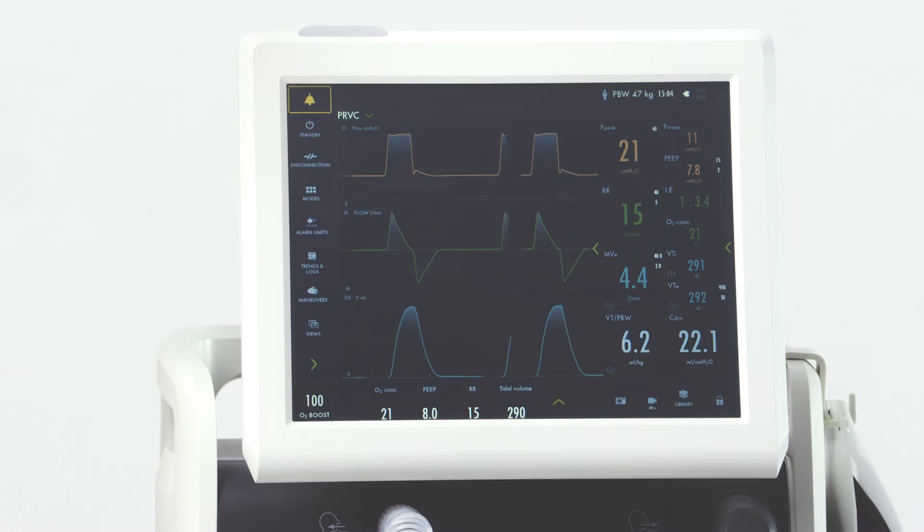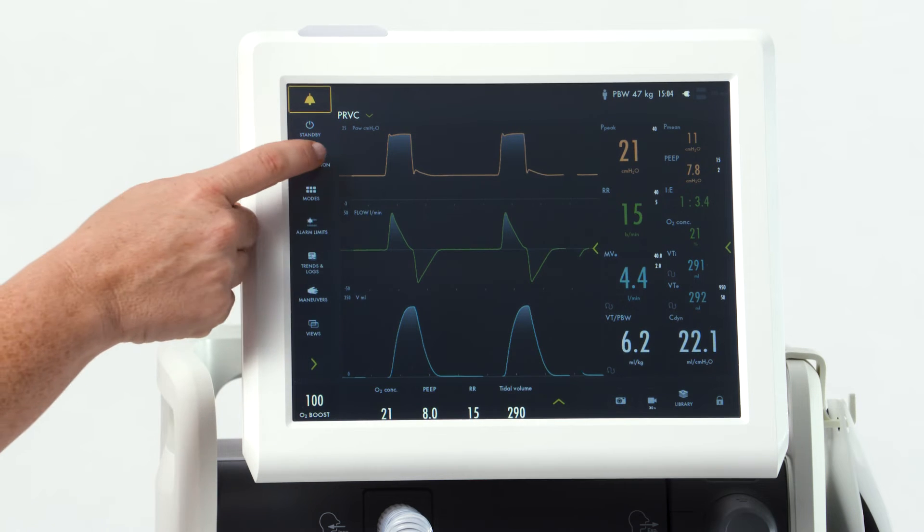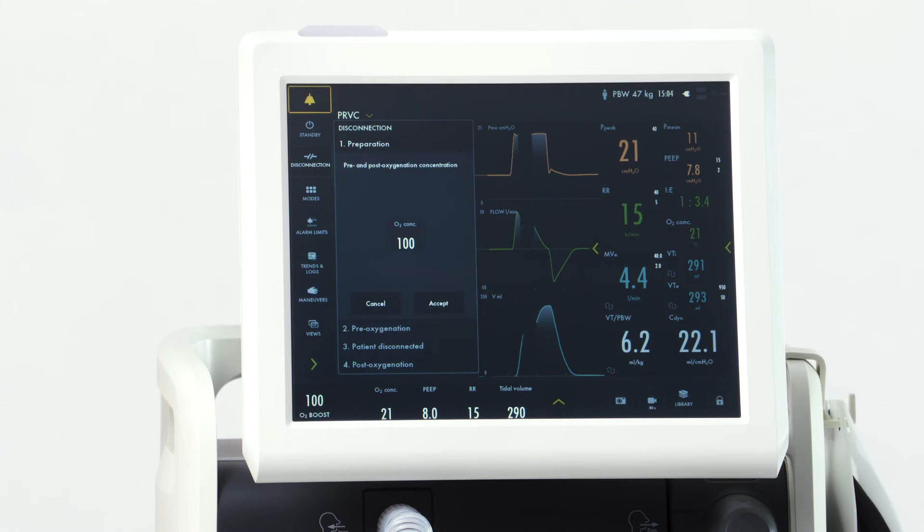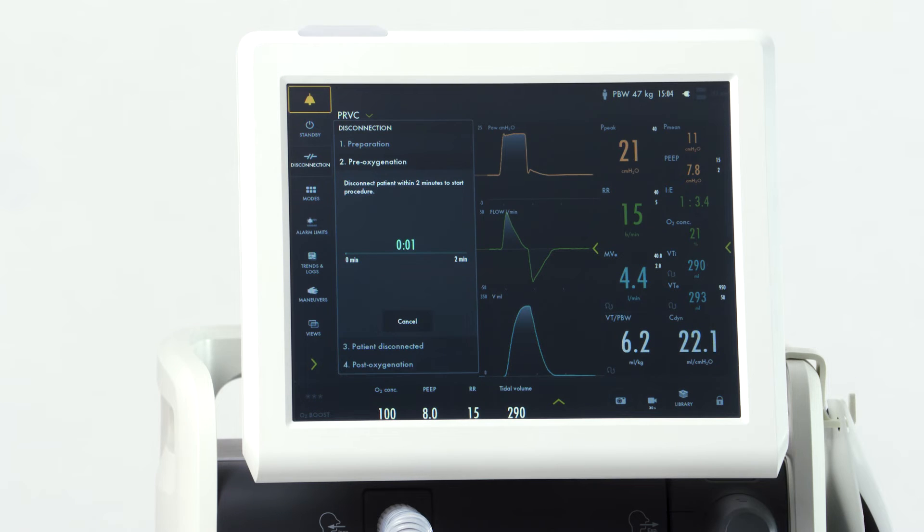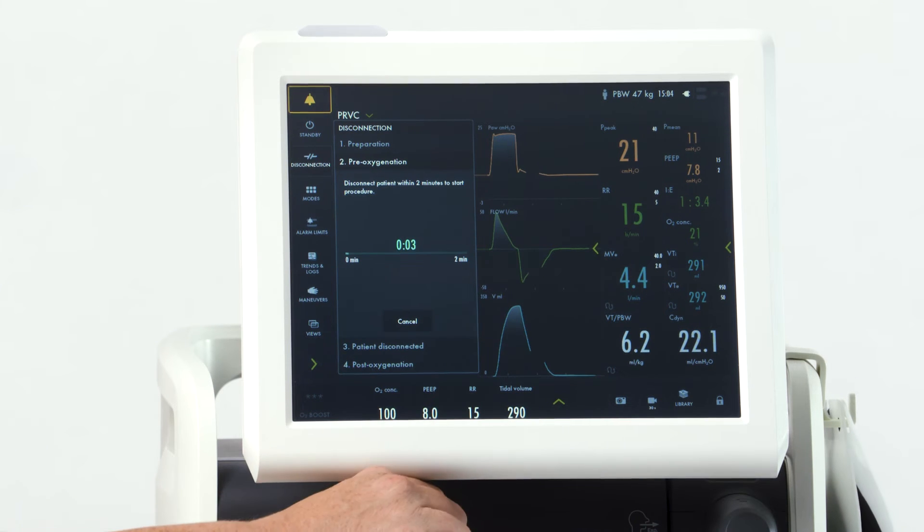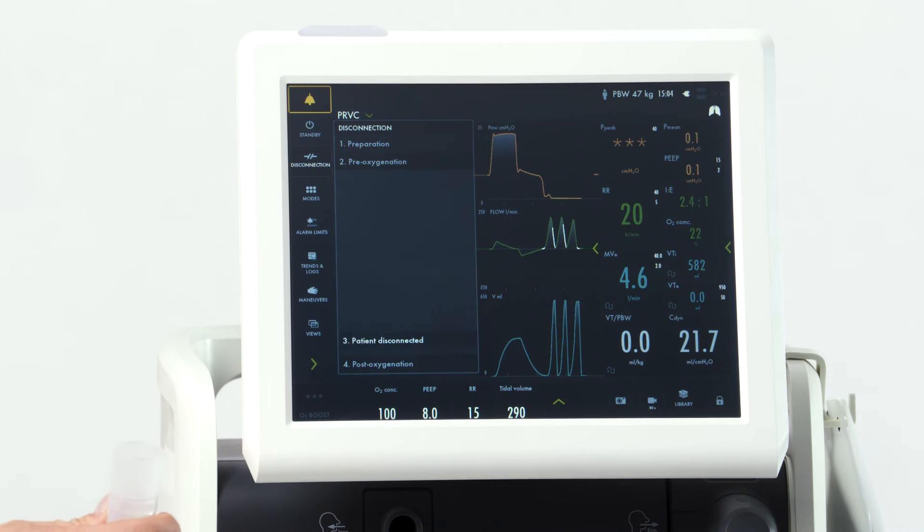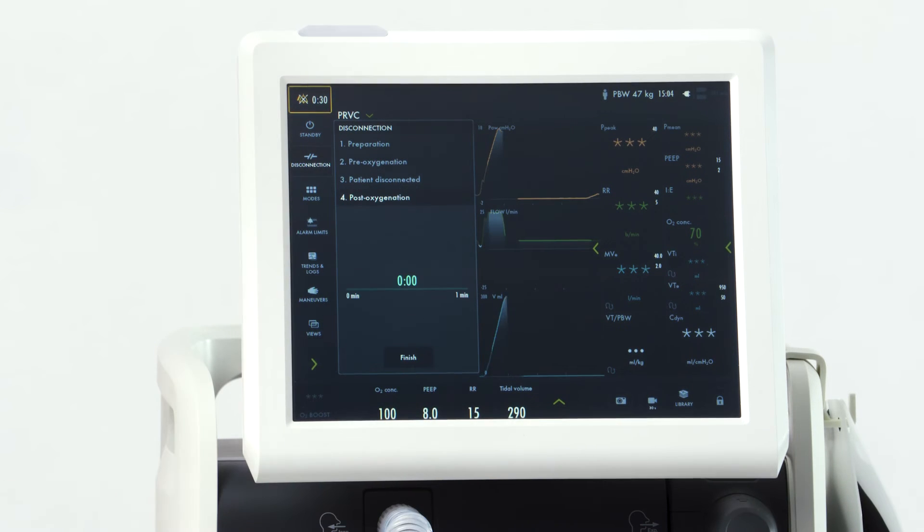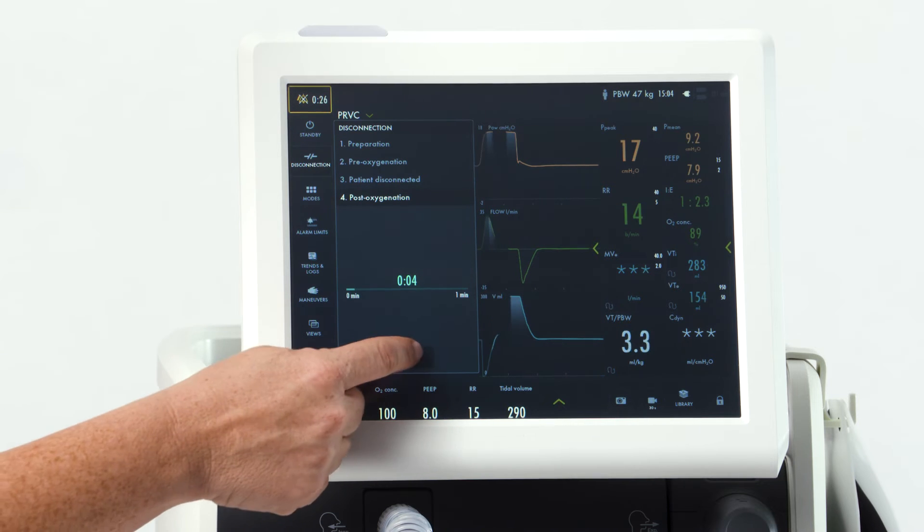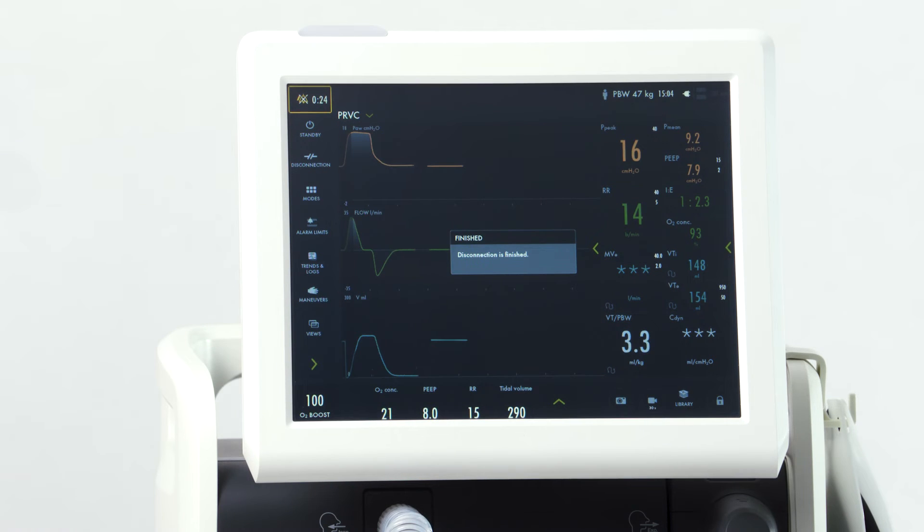When disconnection is needed, simply touch disconnect. It will pre-oxygenate for 2 minutes at that FiO2. Hit accept. Once the patient is disconnected, ventilation will pause, allowing you to disconnect them. Once you reconnect, ventilation will resume and post-oxygenate. Remember, this is not to be used with closed suction.